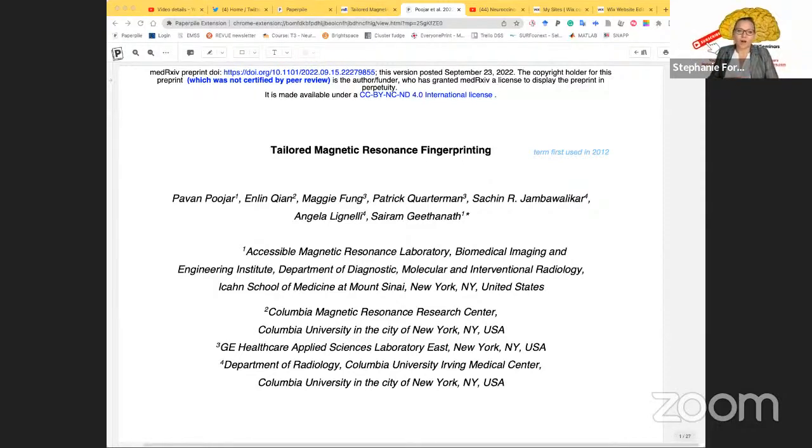And then obviously with that long scanning duration also comes motion artifacts. And then oftentimes to reconstruct the images or to interpret the images, people also need to be trained in specialized software. So that's why generally there is a need for rapid imaging and acquiring different contrasts simultaneously.